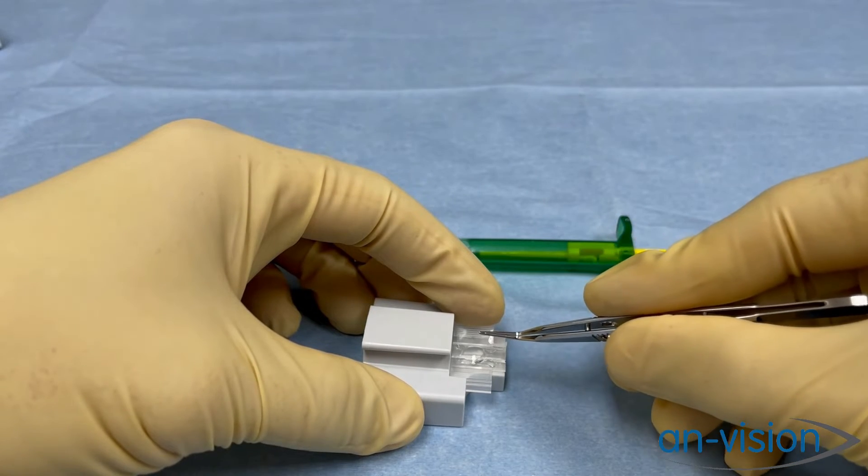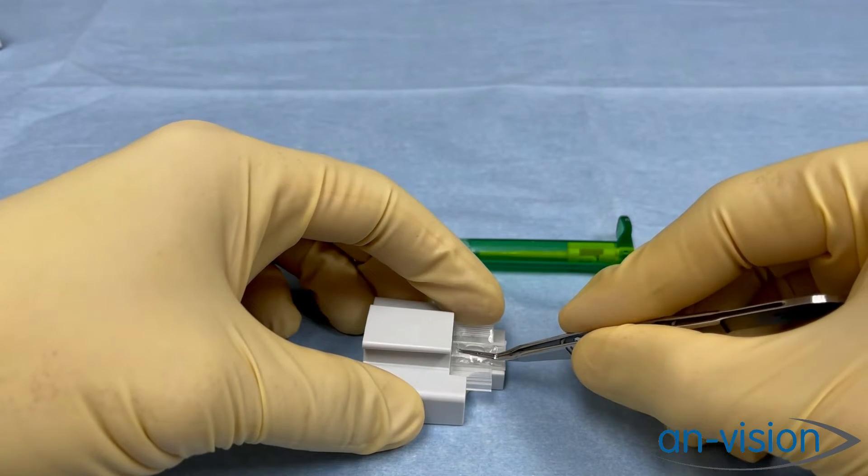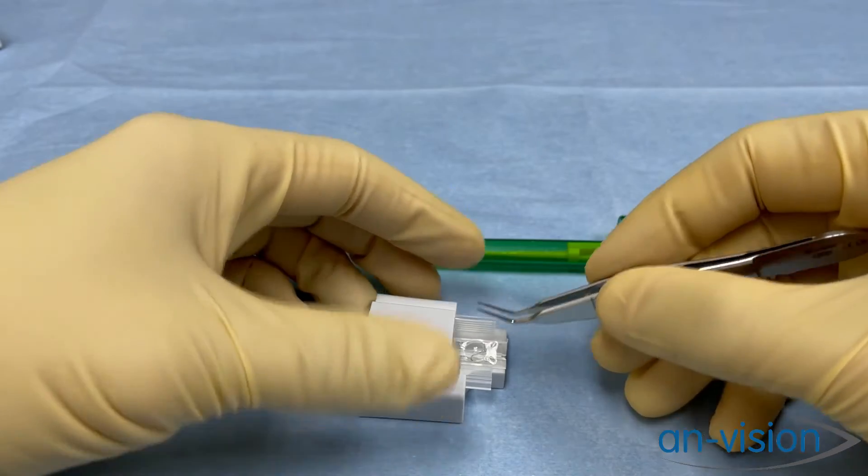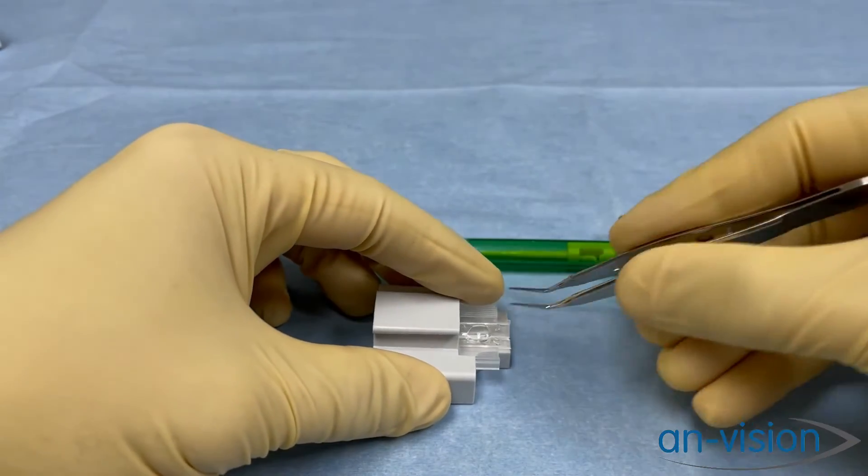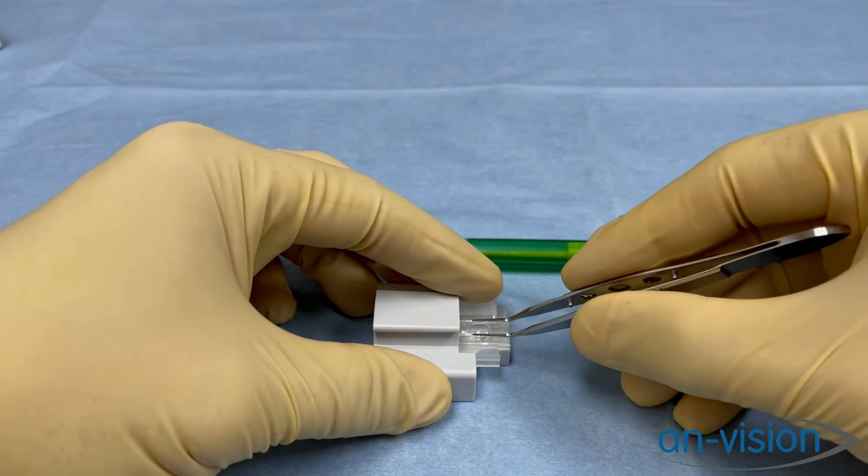We do not want to close our forceps and push in the middle; that will cause the sides of the IOL to fold up and become caught. So, we are actually going to keep our forceps open and only push on the edges as we slowly close.